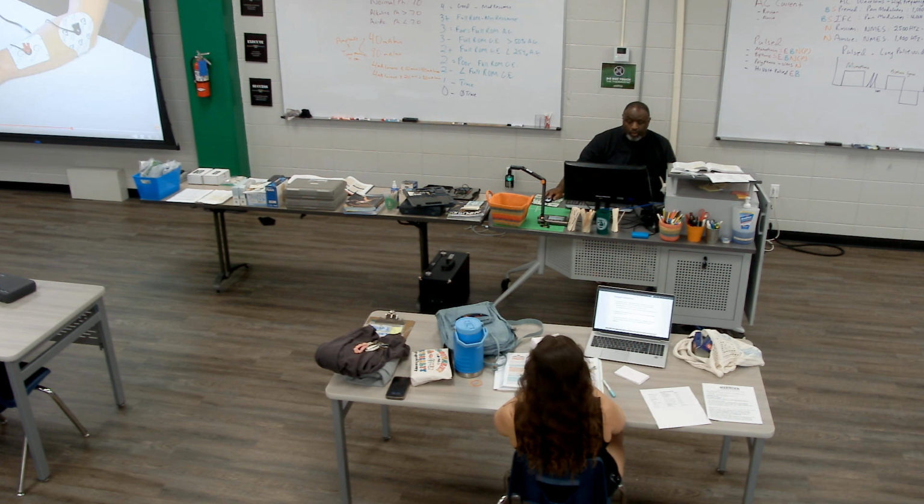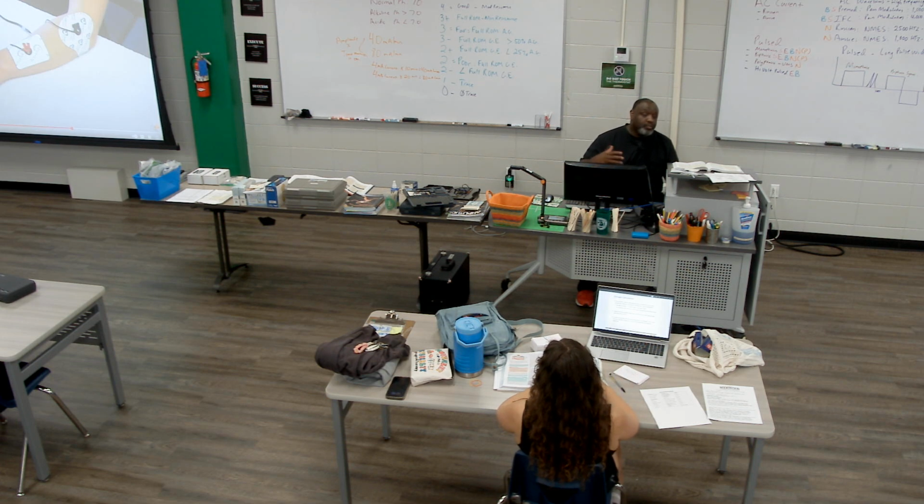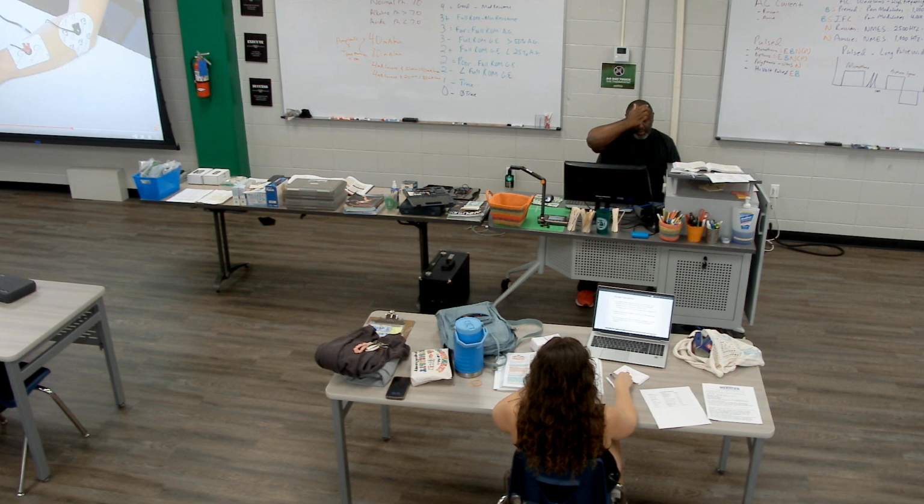So it'll come on at 40, but you can scroll to the right and go all the way up to 80. So you can go up to 80 milliamp minutes, but the typical dosage is going to be a 40 milliamp minute treatment. So that's telling the machine how much iontophoresis you want to perform. I want a 40 milliamp minute dosage, which is pretty standard.